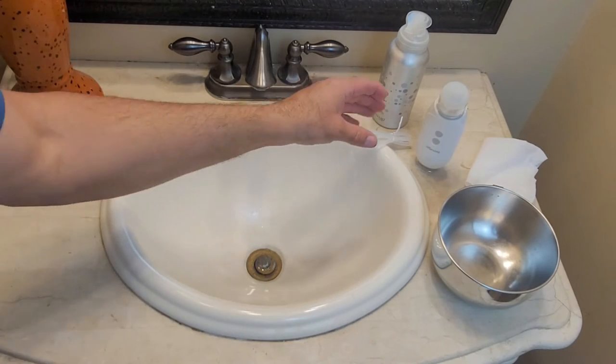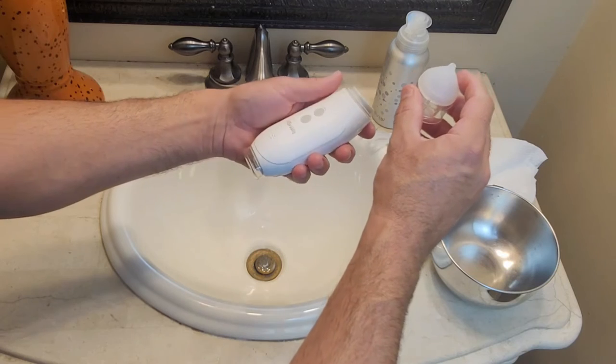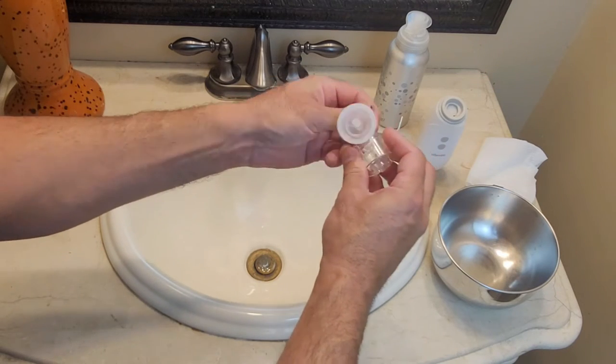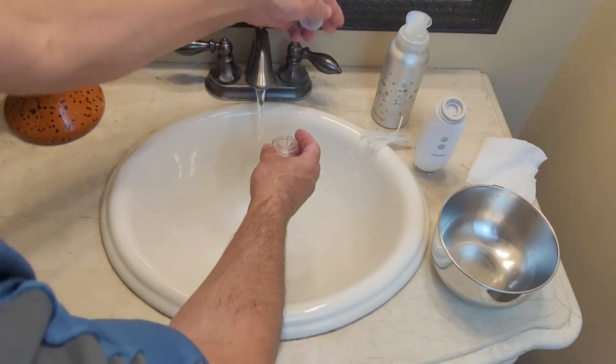Cleaning the device is fairly simple. Just remove your snot container and your silicone top. Go ahead and take those apart just like this — it'll snap right off. And then you can wash these with some mild soap and water.